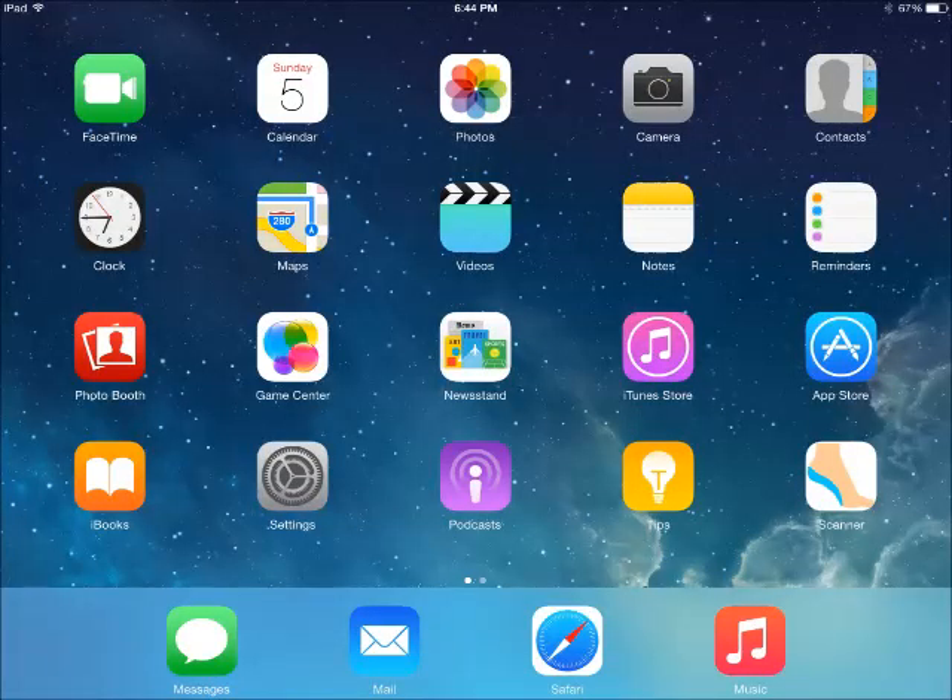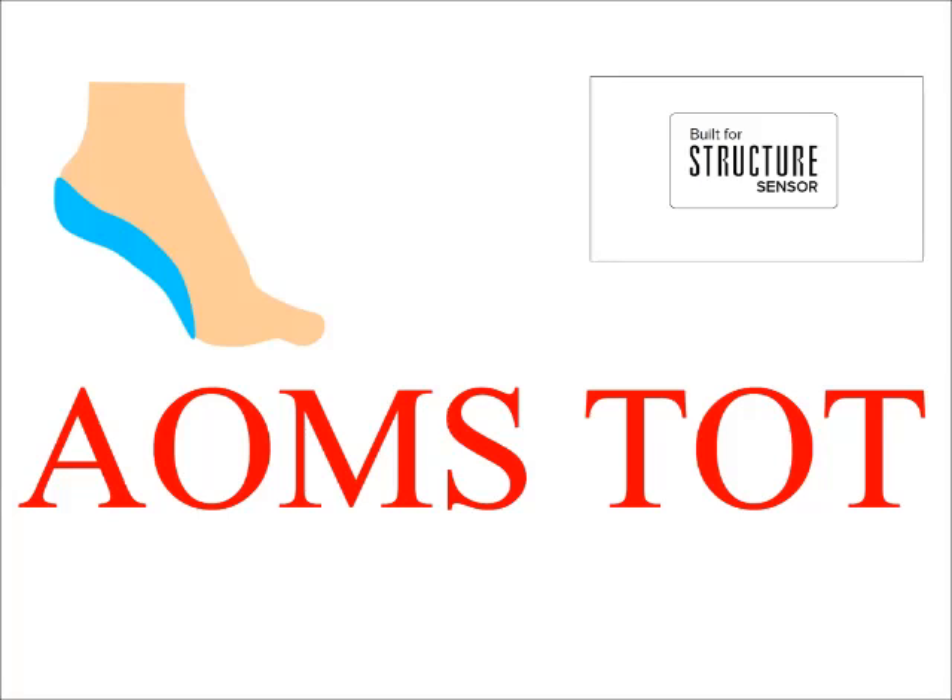You need to have the AOMS TOT, pronounced as Amos TOT, installed on your iPad. To start, just tap the icon shown with the foot and orthotic in it. This app is specially made for scanning feet, positive plaster foot casts, negative plaster foot casts, and foam impression boxes. Let's start with the normal scanning process first.